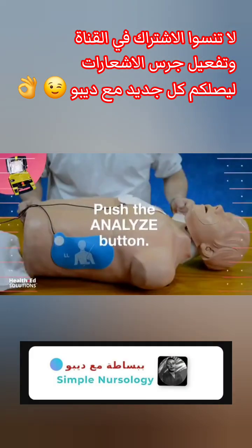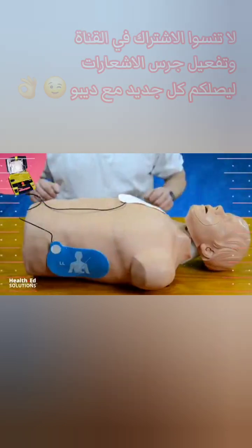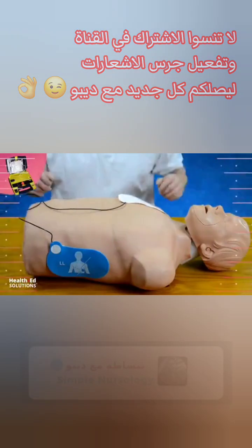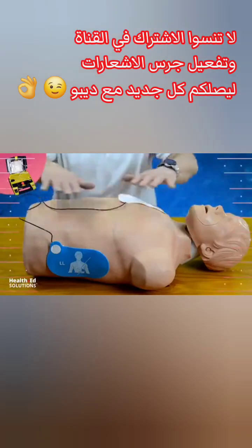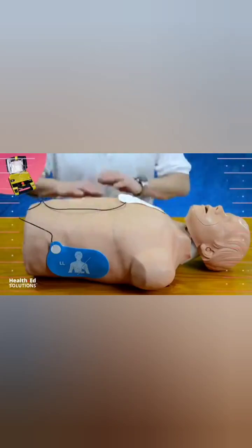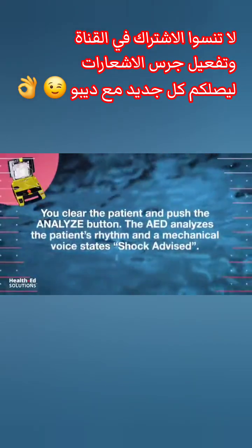Push the Analyze button. The patient must be cleared during analysis, as any movement will hinder the AED's ability to read the patient's rhythm. Ensure that no one is touching the patient during analysis. You should clear the patient verbally, i.e., state "clear" loudly, while looking to ensure the patient is not being touched by anyone, including yourself. You clear the patient and push the Analyze button.